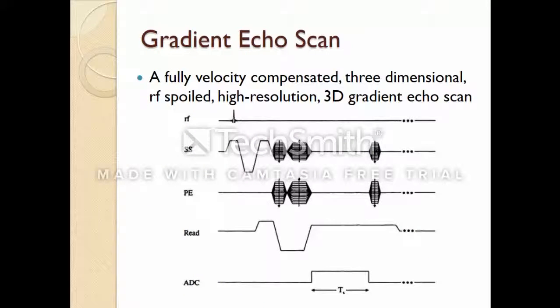Before I continue with susceptibility weighted imaging, one should understand the gradient echo scan completely. Like in any other imaging method, one should first create the transverse magnetization using RF pulses, as you can see here in the picture.